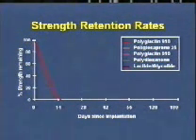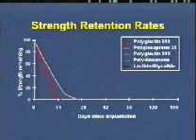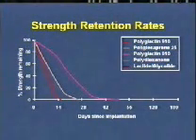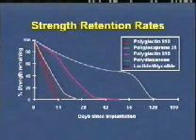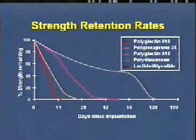Suture strength is usually determined by its knot tensile strength, which is measured by the force which the suture strand can withstand at the point of knotting. The tensile strength of the tissue to be mended, i.e. its ability to withstand stress, should determine the size and tensile strength of the suturing material that the surgeon selects. The accepted rule is that the tensile strength of the suture need never exceed the tensile strength of the tissue.